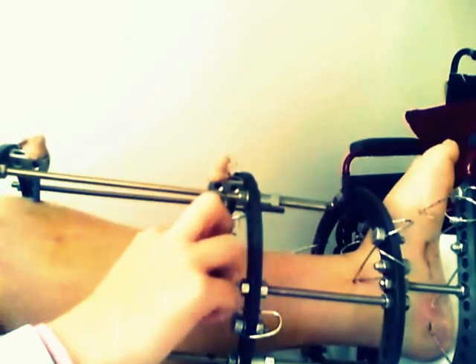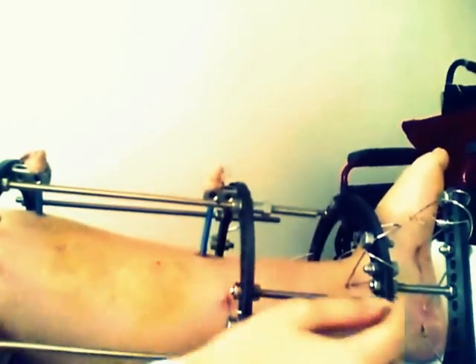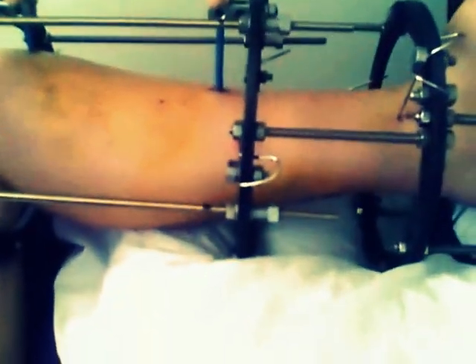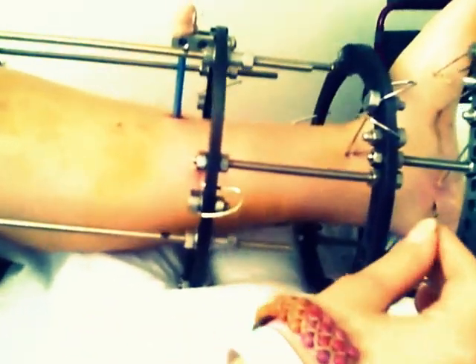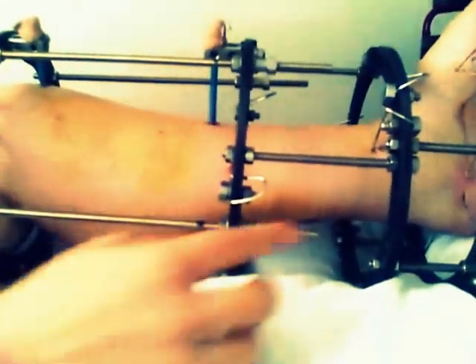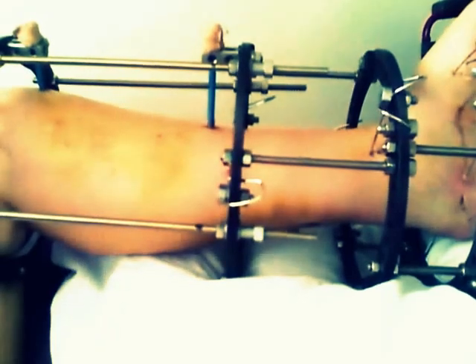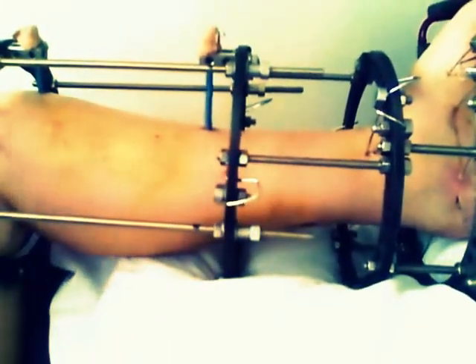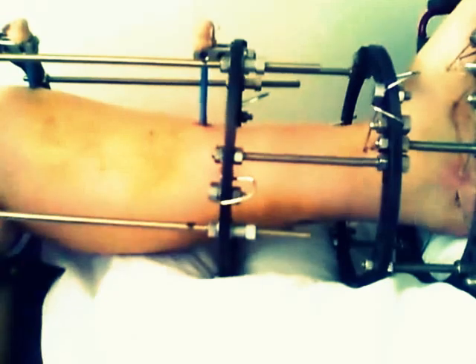And these 2 blue things are holding my bone in place. Because I'm older now, I need more support in my leg, and this is helping me support my leg as well, because otherwise my foot would go. Hopefully after the lengthening, this comes off in day surgery, and this bit has to stay on for another 2 months to let the bone heal properly back into place, because as we're turning it, we're pulling the bone, so it's growing.